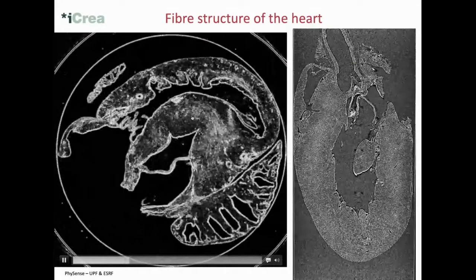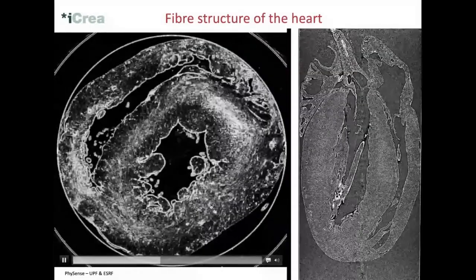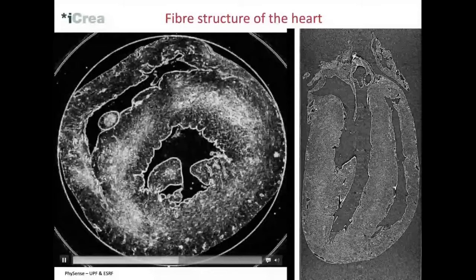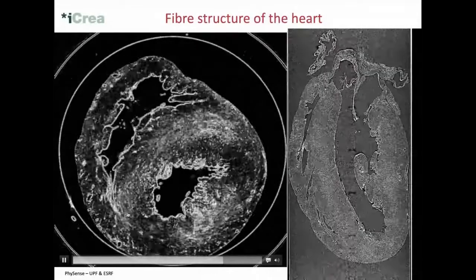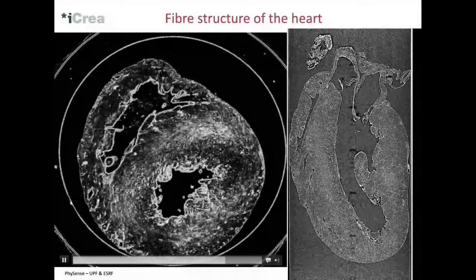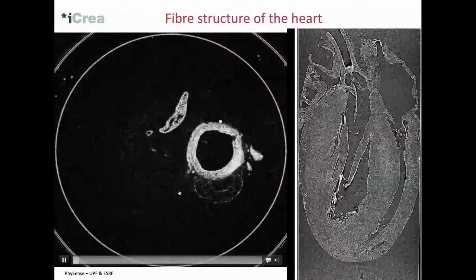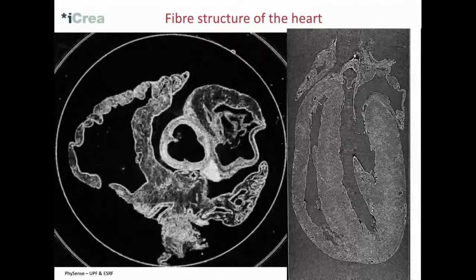And some of the things that you see, you see the vessels, so you can follow the vasculature, so you can nicely see all these things that are moving here. These are clearly vessels. And you see also how these muscle fibers are actually spiraling towards the point. And you see this also jumping in the end. So these are these kind of tendinous structures which are there and you can look at.